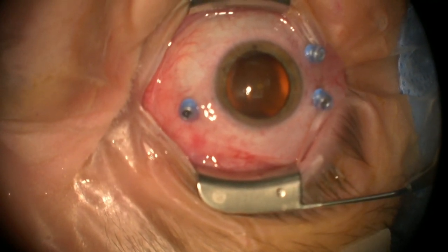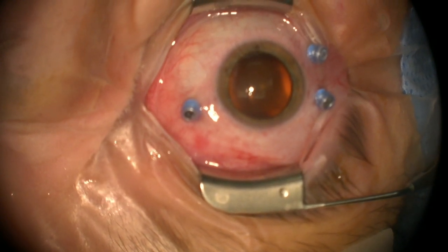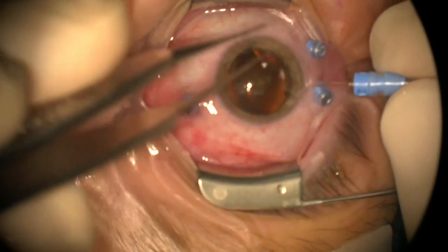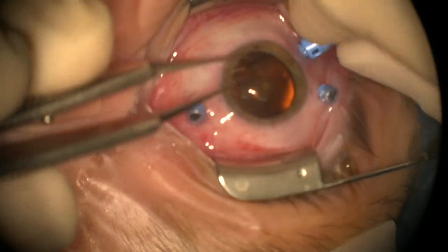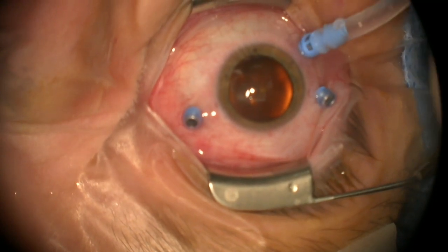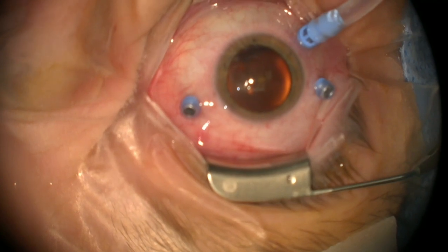We are using a 25 gauge DORC system. And so I put all the cannulas in first because the eye is nicely pressurized. We already have the infusion on, but I also know that it's in the eye. I can see the tip. And we tape in the infusion cannula.